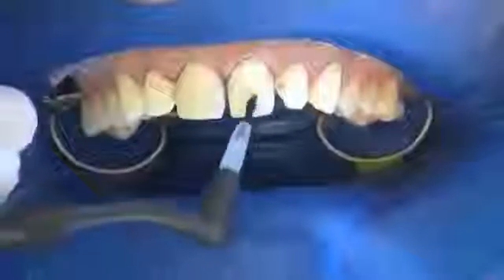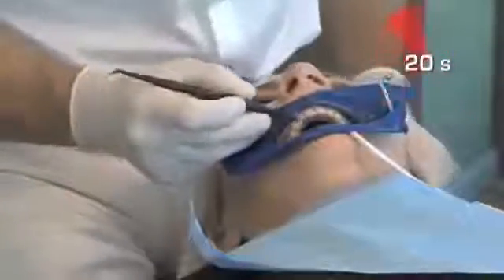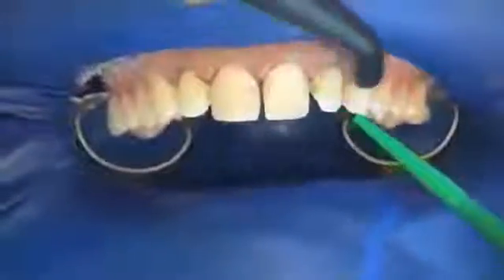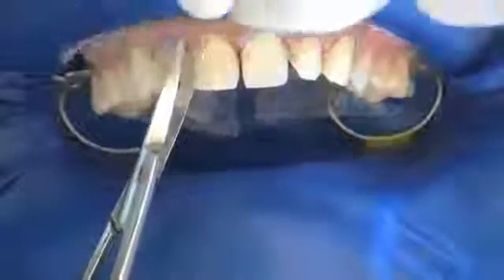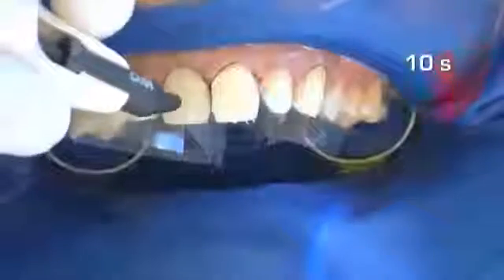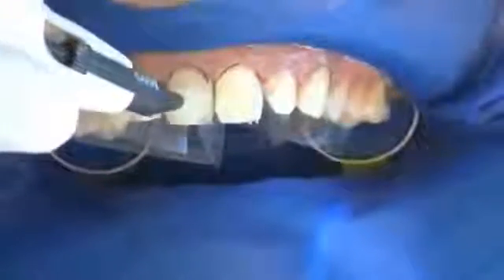One coat bond is distributed evenly to all teeth and massaged in. The reaction time is 20 seconds. The bond is then blown to a thin layer and excess bond is aspirated. Separators are now placed to ensure clear tooth access. Each tooth is pre-cured for 10 seconds. The selected luting composite is applied directly to the tooth and evenly distributed.